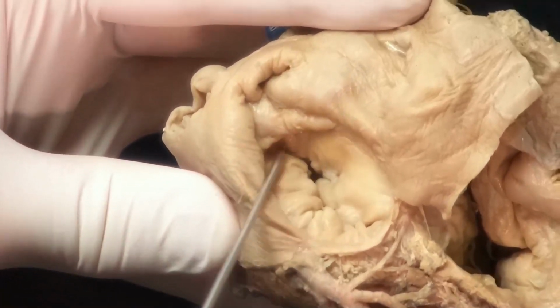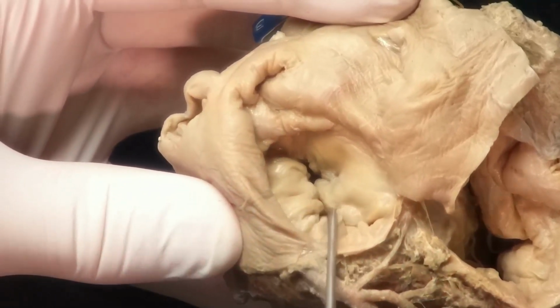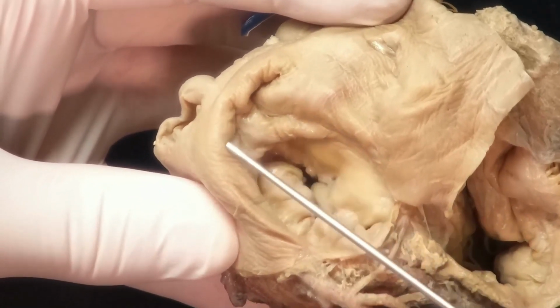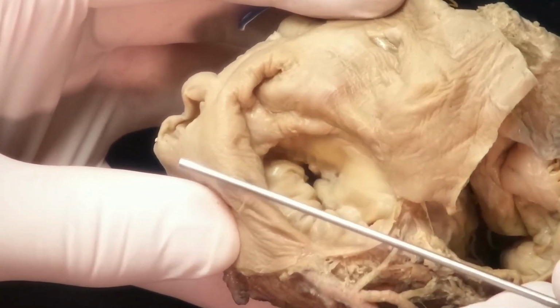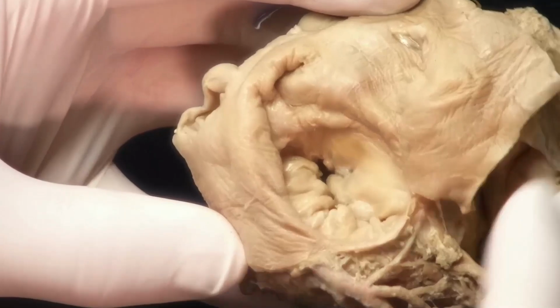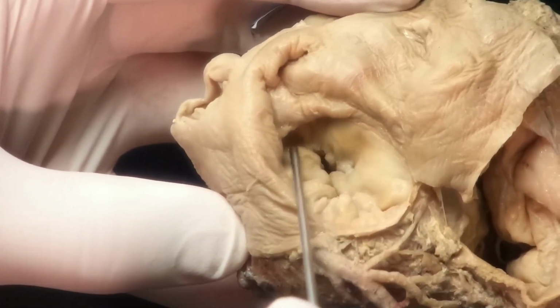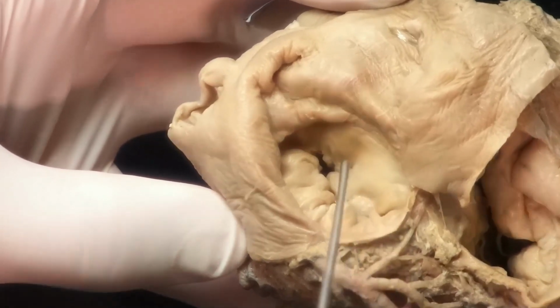So we've got a main zone of apposition between the leaflets, but clearly that's curved. And so that's a challenge for imaging, because we'll be cutting across the leaflets in different forms and different ways depending on the angle that we are actually cutting the annulus. And then, of course, for clipping, we ideally want to be perpendicular to that zone of apposition, that main zone of apposition, and that's curved.